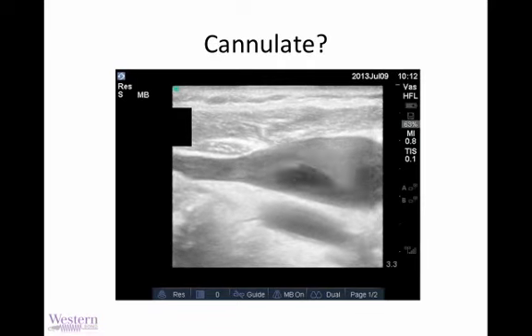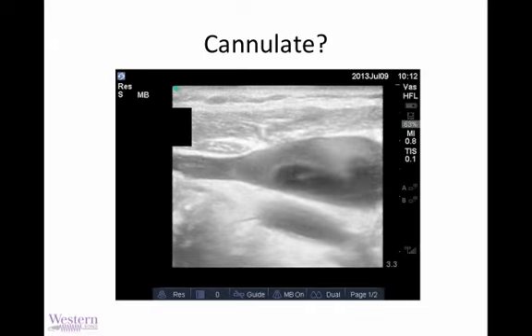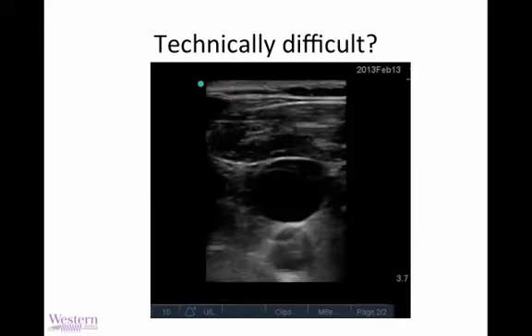When there's extreme turbulence in the vein, as in the case of, say, SVC syndrome or other unusual diagnoses, it's probably best not to stick thrombogenic catheters in the midst of a clot in process, as you can see here with the spontaneous contrast in the IJ.